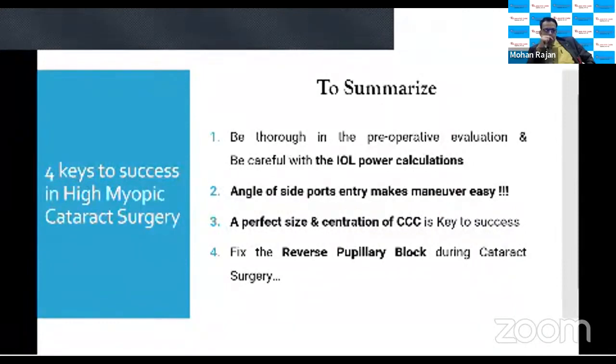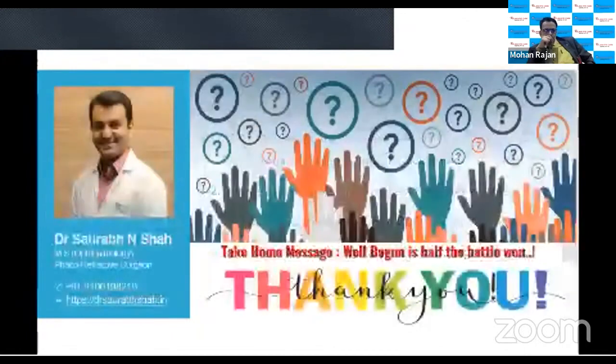So here are the 4 most important points that you have to remember for high myopic cataract surgery. Thank you.